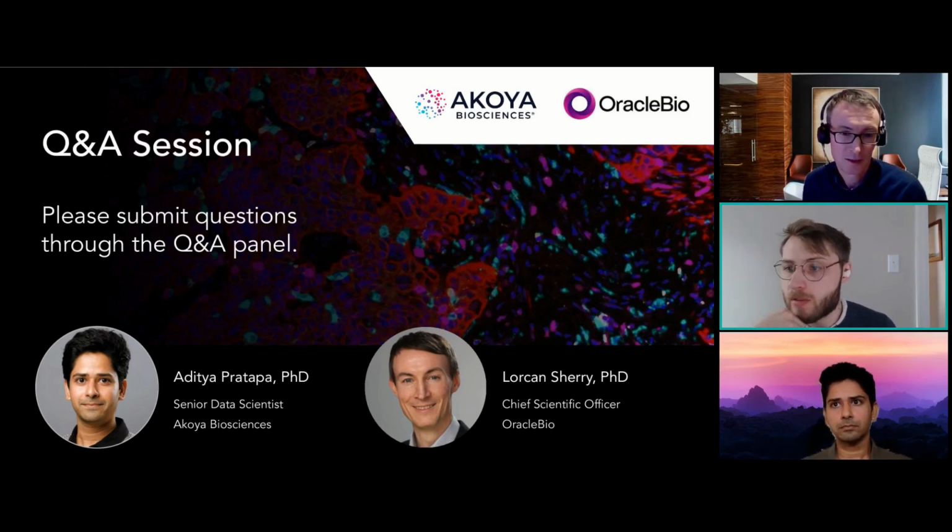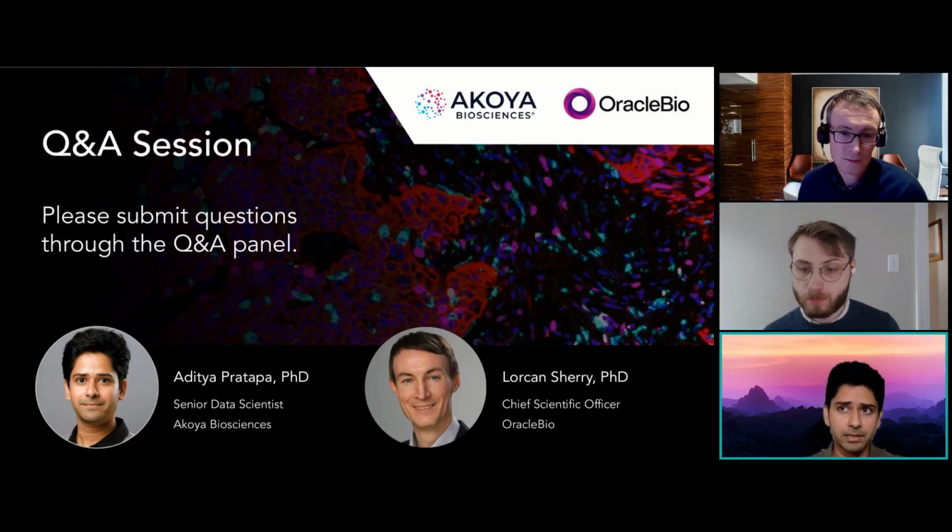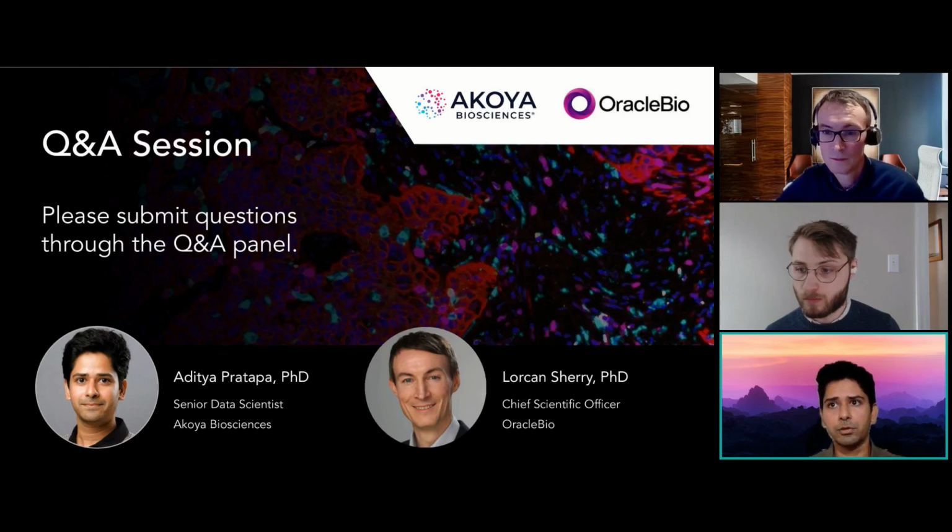All right, so is imaging for phenocode signature assays any different in terms of the unmixing and autofluorescence removal? Eddie, I think this one's for you. Yeah. So the guidance remains the same in terms of creating the unmixing library, both for the OPAL assays and the phenocode signature assay. But the official recommendation is that you create a phenocode signature specific library and for the tissue type that you're working with, because that can change from tissue to tissue.